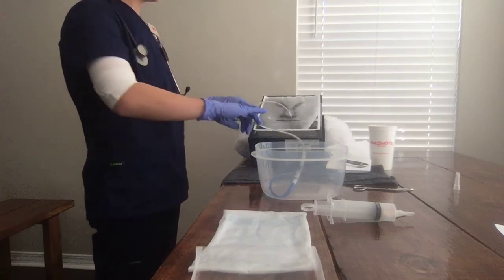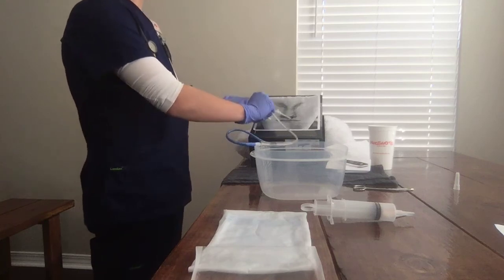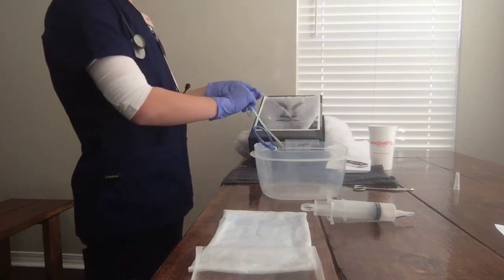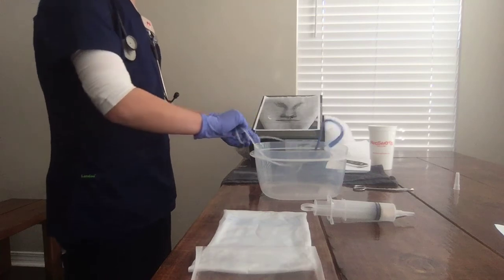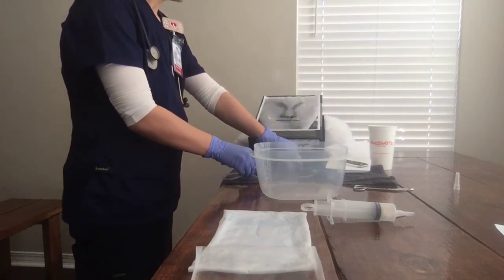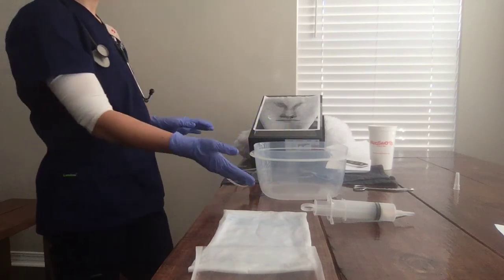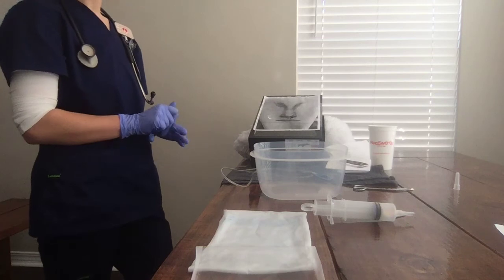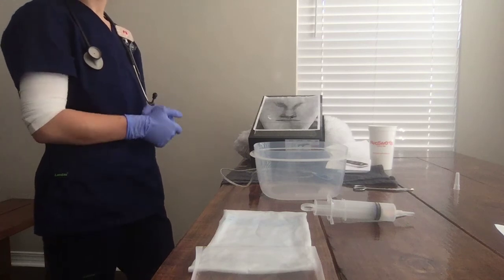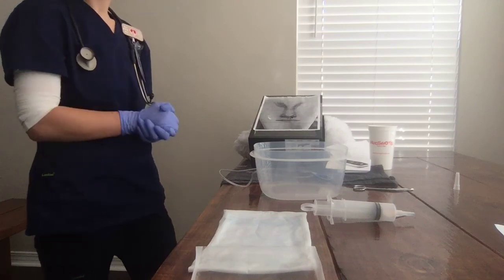And I'm going to kink the tube before I remove it, so I have it kinked. Then I'm going to remove it fast. I'm going to put it in the towel so I can gather all that. And then I would measure the drainage if there was any. I would also provide oral care for the patient, and then I would document the procedure.